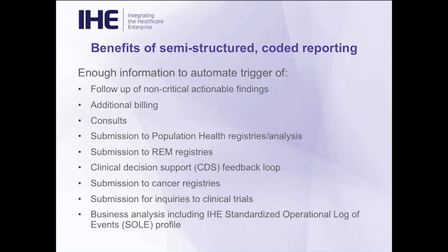Some of the benefits of semi-structured or coded reporting include being able to perform the follow-up of non-critical actionable findings. That's a Category 3 in the American College of Radiology, which is often called an incidental finding. As a matter of fact, it is because of a profile that is being written on follow-up of non-critical actionable findings that this particular profile in results distribution actually came to be.